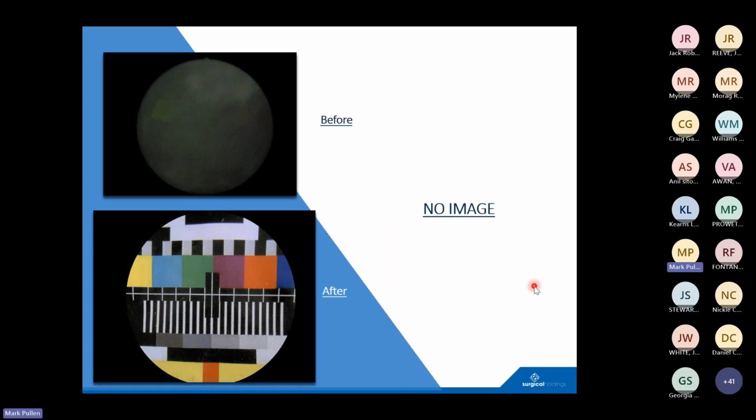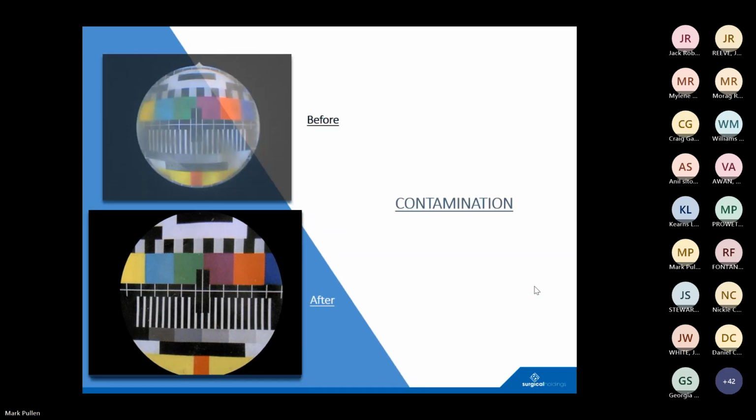No image. So, fairly self-explanatory. This could be a mix of any of the previous faults: multiple broken rod lenses, a shaft completely snapped off, an angry surgeon, something like that. There's no real way of telling what this is until we get the scope open.